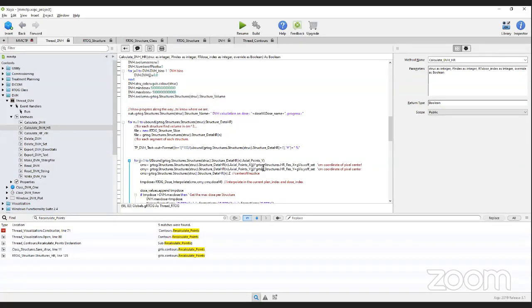So how can we then correlate that this much of dose bin spacing should be used while calculating DVH? Well, I don't have a good answer. I mean, I think it's user dependent.